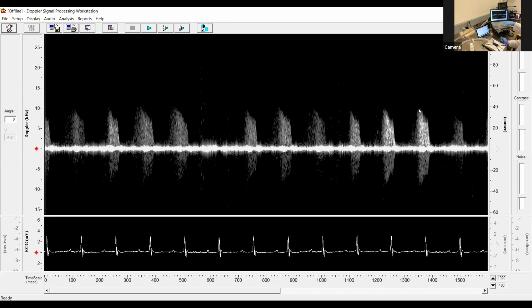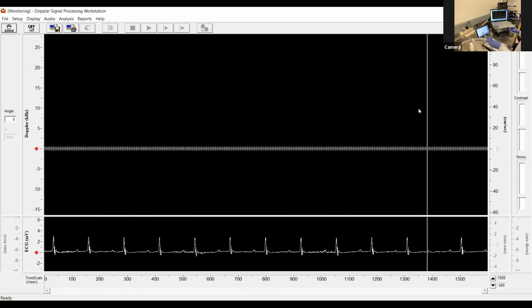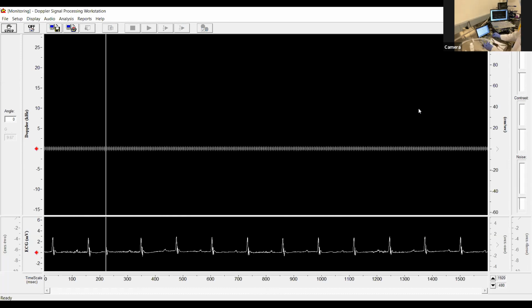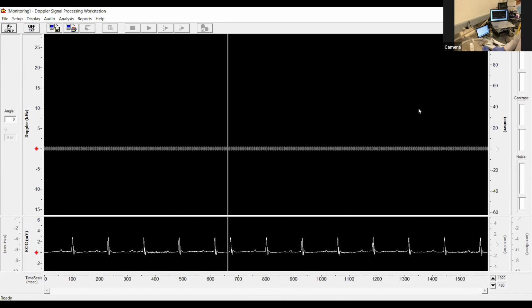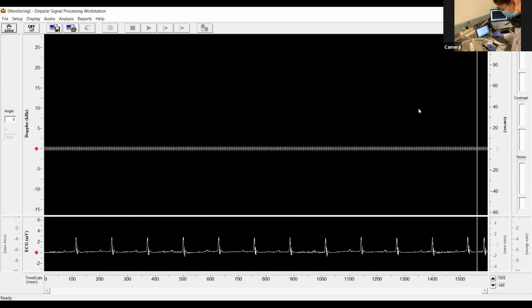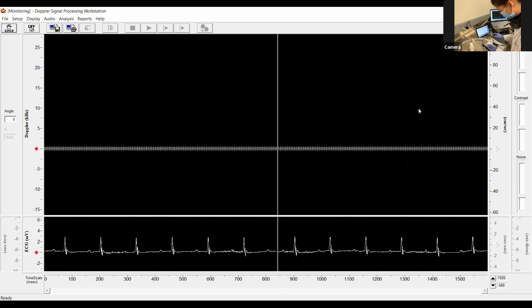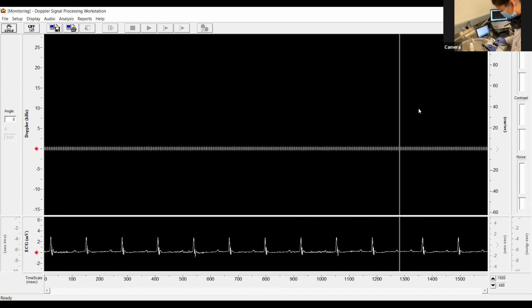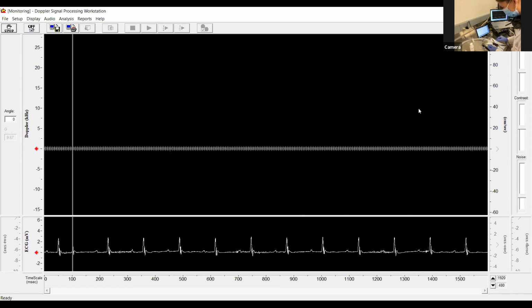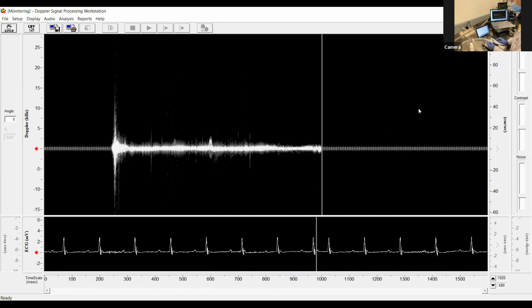So now you want to move to aortic outflow? Perfect. Great. There is also a foot pedal. We don't have it connected, but the foot pedal can be used so that as you push it, it would save the spectrums that you had just acquired onto the computer. So you can do it hands-free and use your hands to take the images.